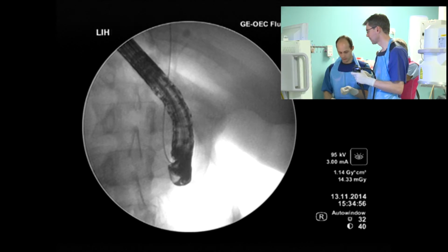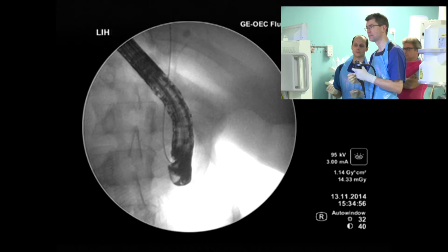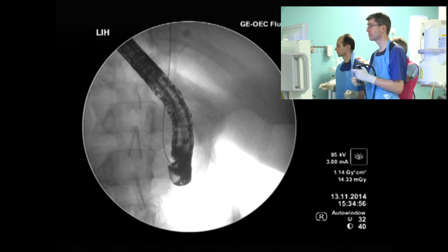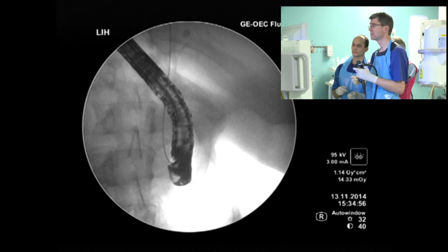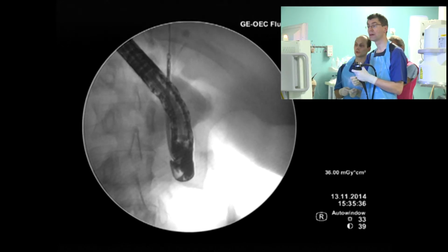Yes, please, we're listening to you. Could you tell me, please, Evgeny, since you do multifocal biopsy, it is clear that the material you're taking should be clearly marked and stated in the document. So the first 3 biopsies are done from one zone, then you go up, to reconstruct the morphology using those, because they might be different.